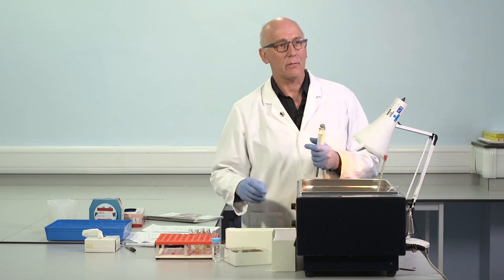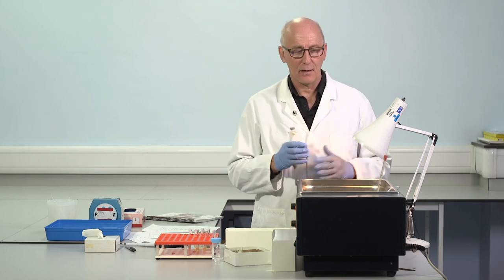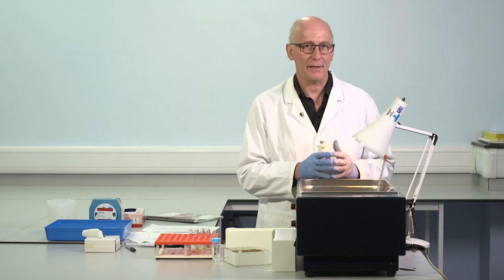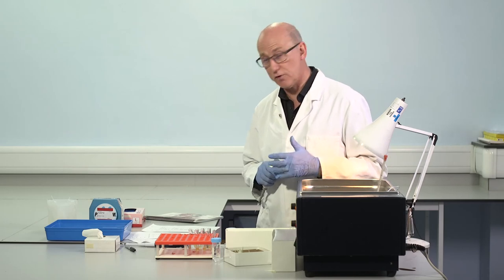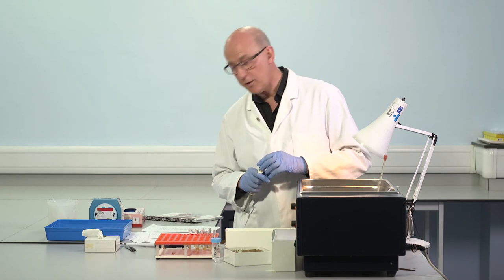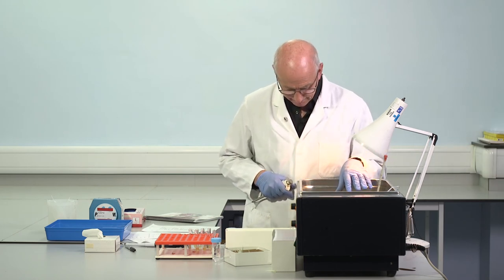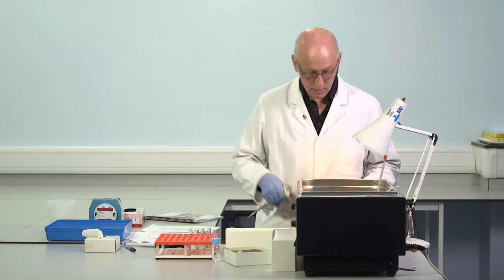The other important point about such patients with prekallikrein deficiency: no bleeding tendency. Absolutely no bleeding whatsoever. In relation to that, they behave in a normal way. So the most prolonged APTTs we saw, if you remember, were in number 2, number 3, number 4, a little bit shorter in patient number 1. Control is incubating. And we're up to 3 minutes.